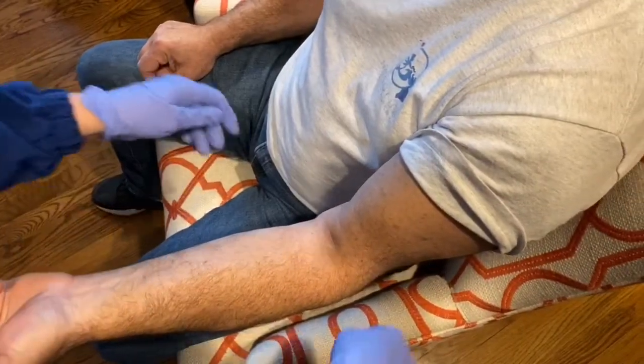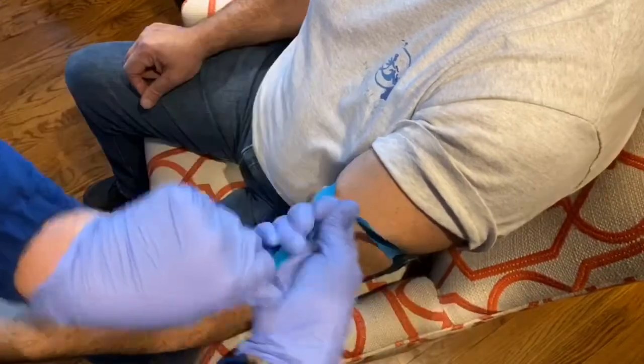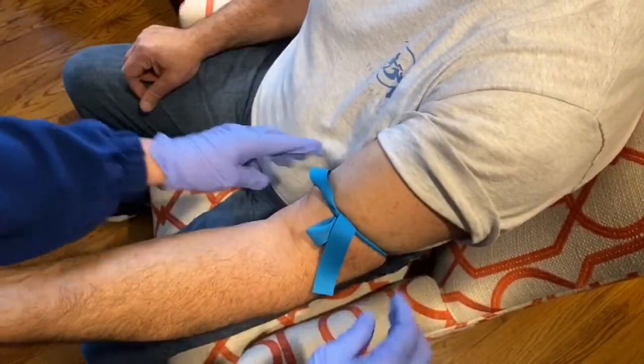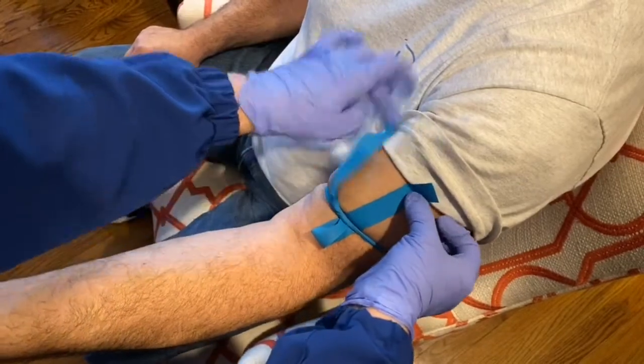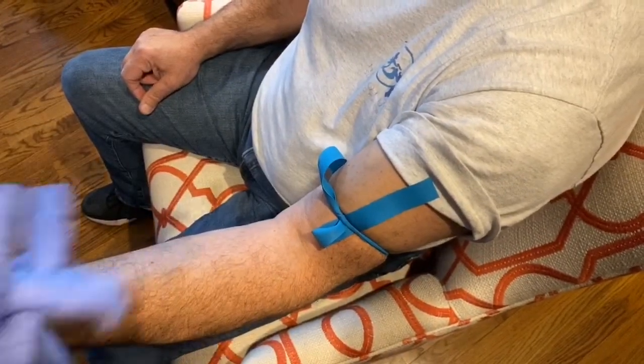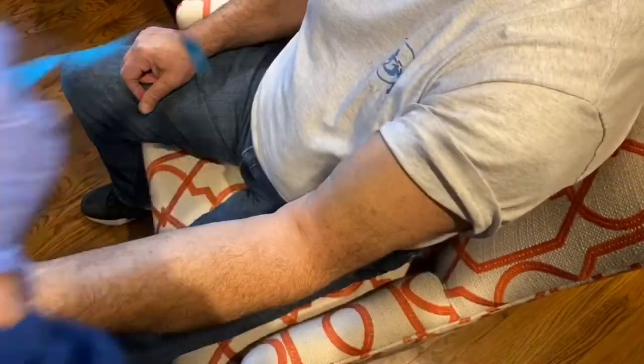So now I'm going to show you quickly. Always make sure that your tails go towards the head, so you don't contaminate the actual site that you're going to stick. Quick release — and voila.